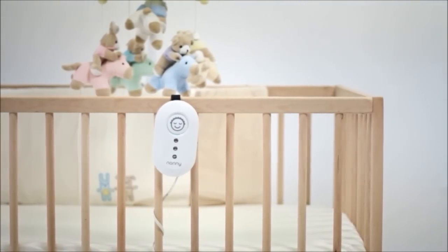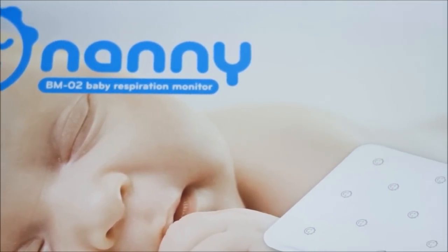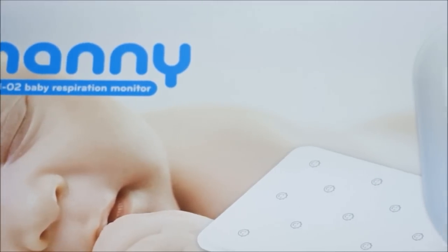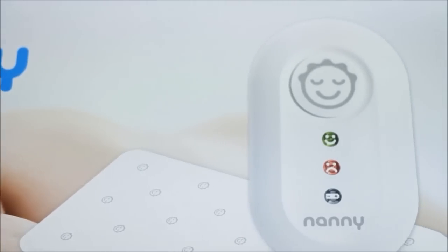Nanny will also inform you if the baby's breath is too shallow. If the baby does not breathe more often than 8 times a minute, the alarm is triggered immediately. You can be by the cot in time and help your baby if needed.